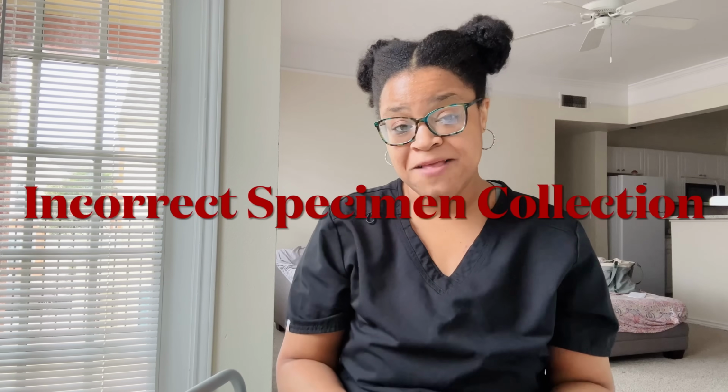How to fix that is very simple. Just tell them to make a fist. As soon as you put the tourniquet on, tell them, can you make a fist? That's it. Another common mistake that a new phlebotomist can make is incorrect specimen collection.